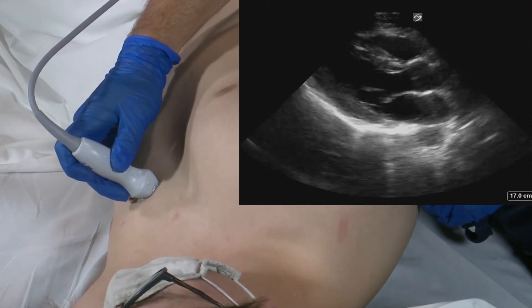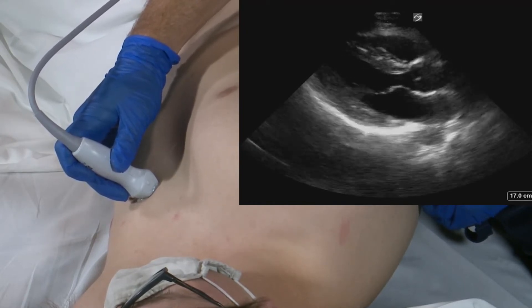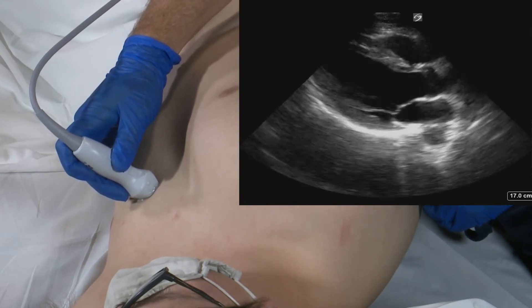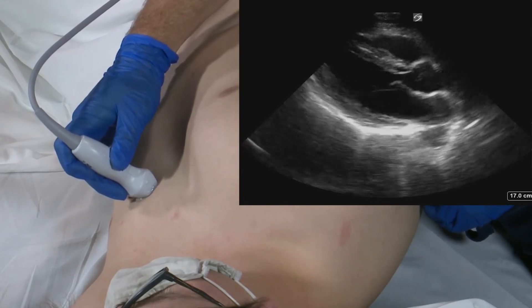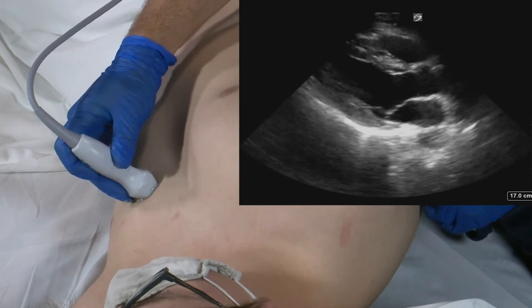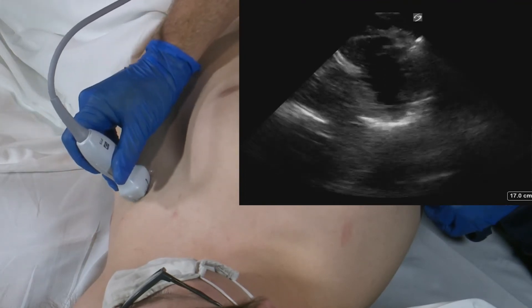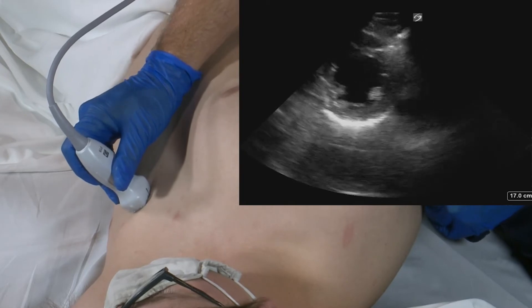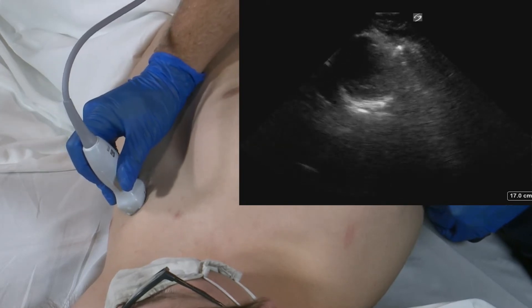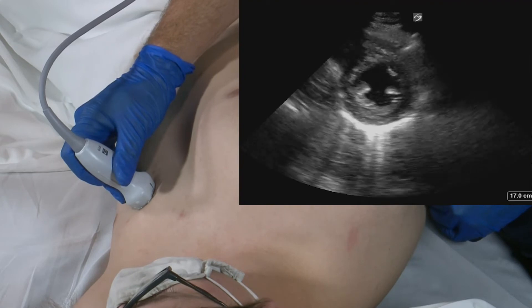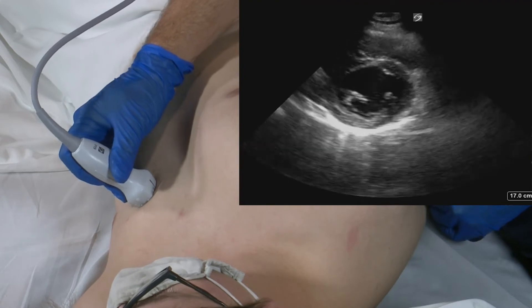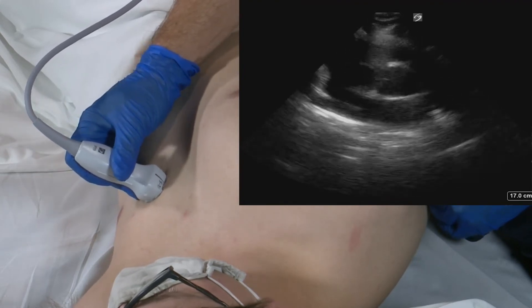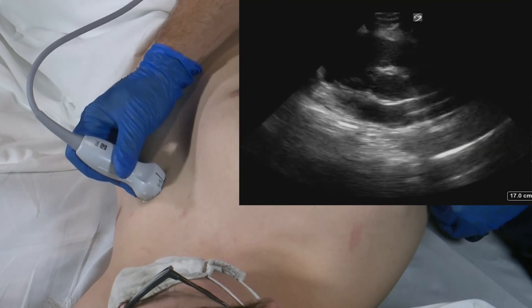Once we've had a satisfactory parasternal long axis view, we're going to rotate the transducer 90 degrees towards the patient's left shoulder for our parasternal short axis window. In our parasternal short axis view, we're going to move the transducer and fan it towards the apex, towards the mid portion of the left ventricle, and up towards and through the mitral valve and onto looking at the base of the heart.